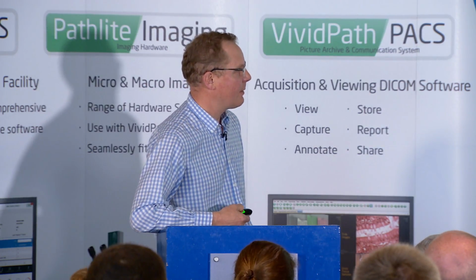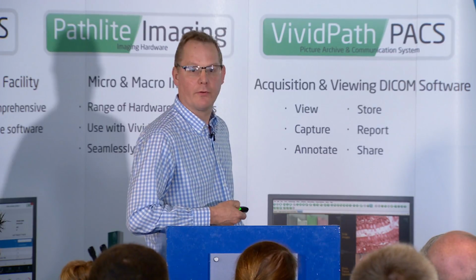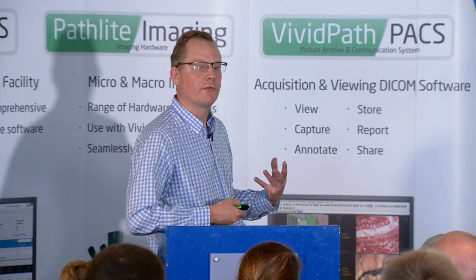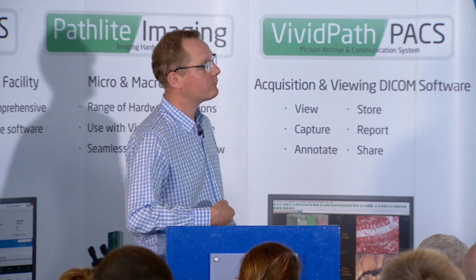Anything which you require the pathologist to initiate, i.e. find the tumour and then ask what grade it is, has to work either at the pathologist where he's working or downstream of him. So if it's a case of cancer grading, it's a tool which has to be on the workstation, operating at the time the pathologist says, there's a cancer, what grade is it?